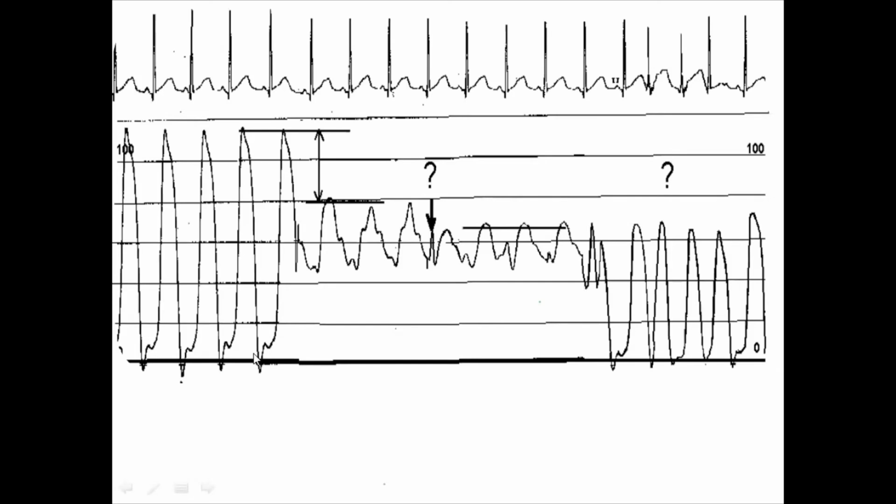Is it simultaneous or pullback or withdrawal? It is pullback. Am I right? Okay, pullback, yes. And so the next is between the LV and the aorta. So you mean the first chamber here is the LV, and here is the aorta. From the shape and the tracing from 0 to 100, with pressure around 120/10, this is LV. You are right. So here from LV to aorta. Agree? The shape is arterial and the pressure goes with the aorta.